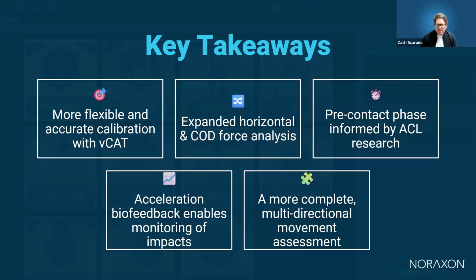And finally, we have the acceleration-based biofeedback, which enables real-time applications like monitoring tibial shock during running with those inertial sensors, and adds an objective way to assess impact loading during rehab, technique training, or these return to run progressions. And so, taken together, these updates help you build a more complete picture of movement across clinical assessments, performance testing, and research as well.